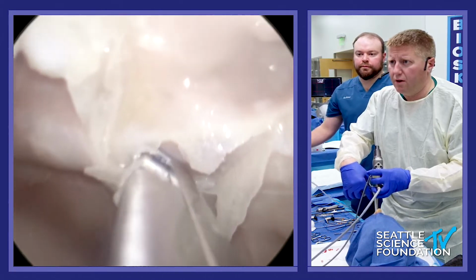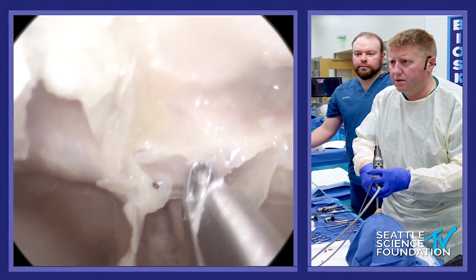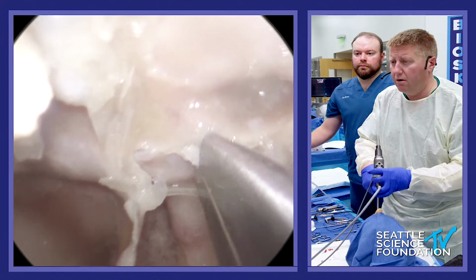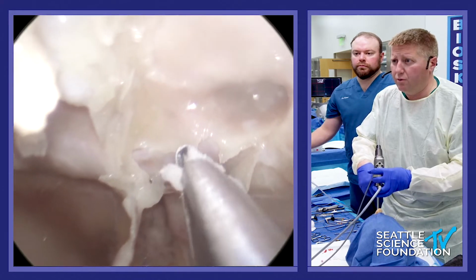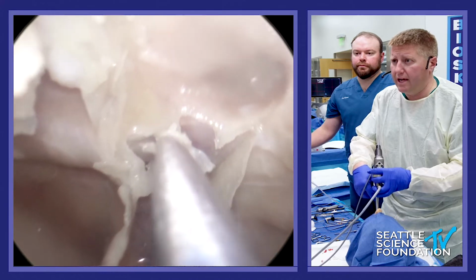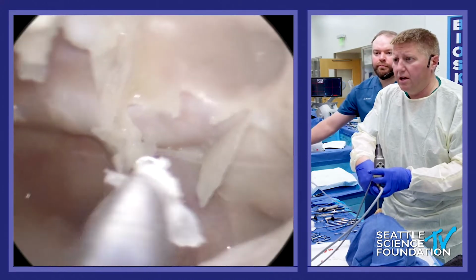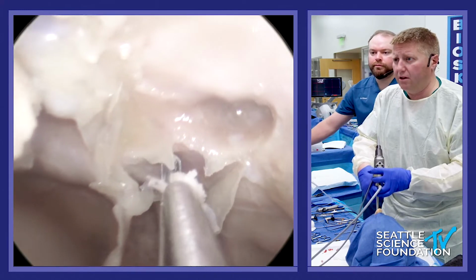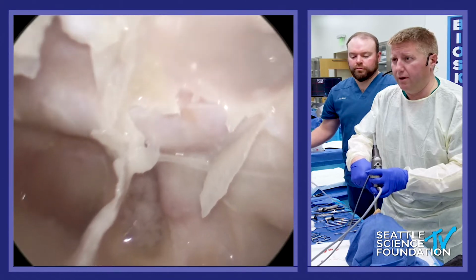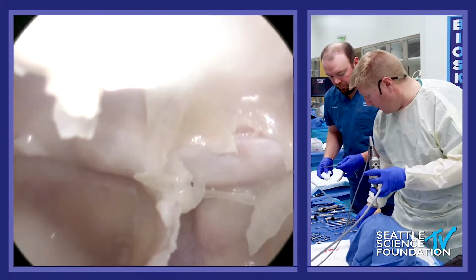So we've got the dura overlying the pituitary sitting out in front of us. And the extent of dissection that you want to do here really depends on what's your tumor size, where you're trying to get to. Do you need to take this really far up to the planum to get access there? Is this going down into the clival recess? It really depends on the pathology that you're dealing with. So that's your pituitary approach.